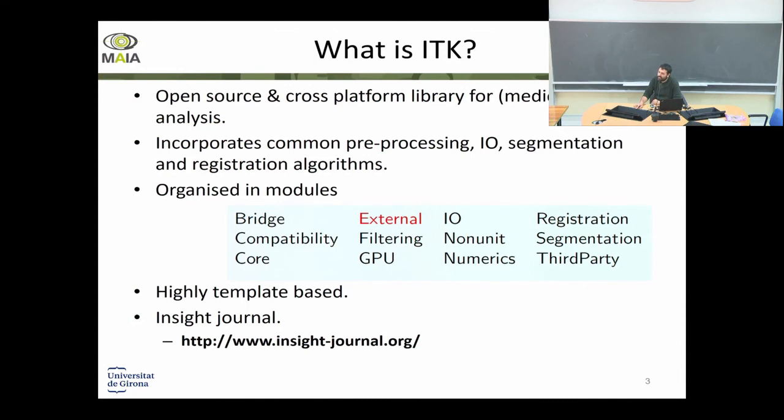Sorry? Like when you want to find an object? When you want to find an object in an image? Combine images from different scanners and try to make that as one. Okay. You can find an object in an image, but the main characteristic of image registration is that you are not working with one image. You're working with two images at least, or several images of the same area or the same thing that you want to analyze. And for instance, you want to check the difference between the two images.